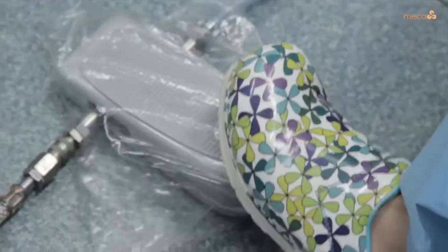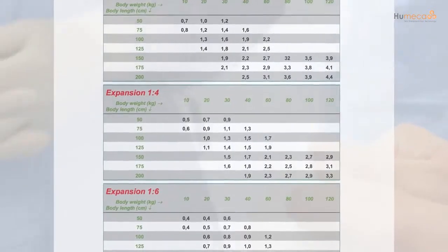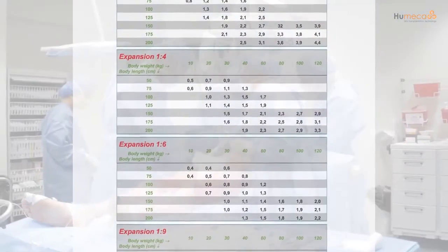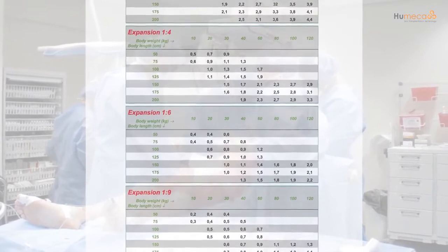The required air pressure is 4 to 8 bar. Air supply is controlled by pressing the foot pedal completely down. Estimate the amount of skin you need to harvest; use the sheet indicating the number of Meek gauzes required per percentage TBSA as a guide to indicate the amount of gauzes you need and therefore the amount of skin you need to harvest.